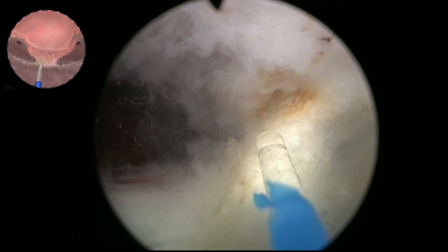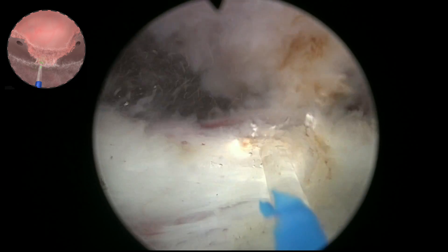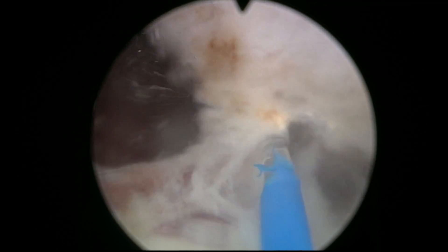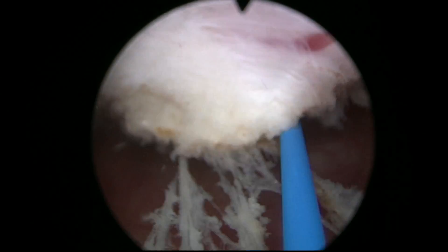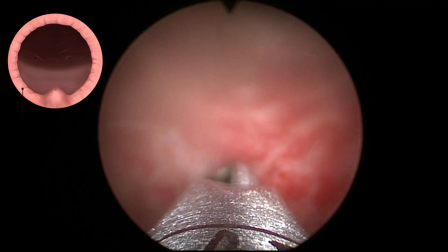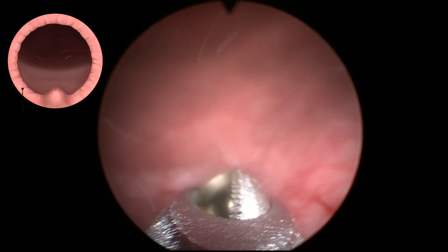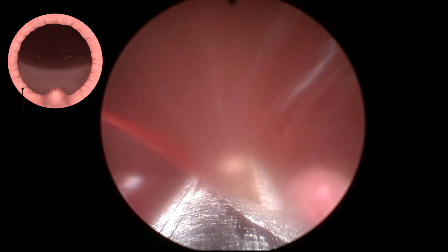Then the 6 o'clock fibres are cut to complete enucleation. It is a fast procedure, easy to visualize, with great hemostasis also thanks to the virtual basket pulse modulation. The perfect preservation of the sphincter mucosa allows for perfect continence after the procedure in the majority of patients.